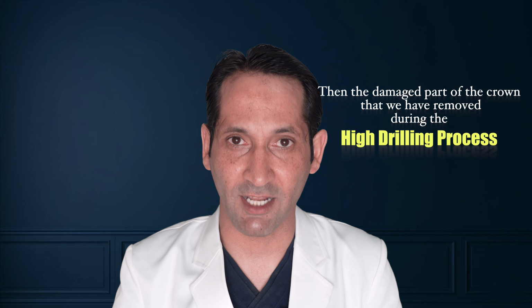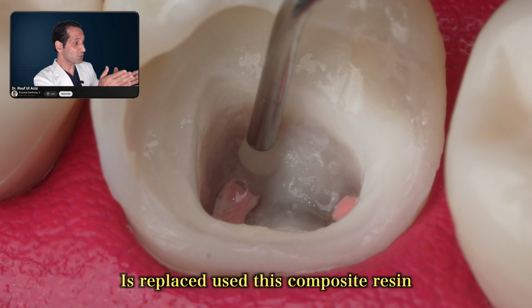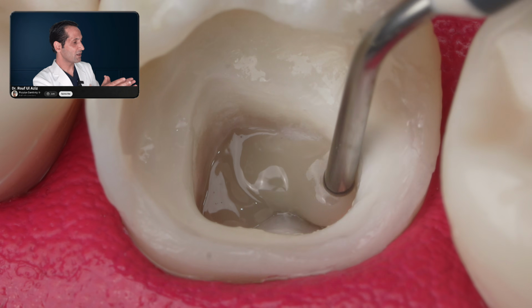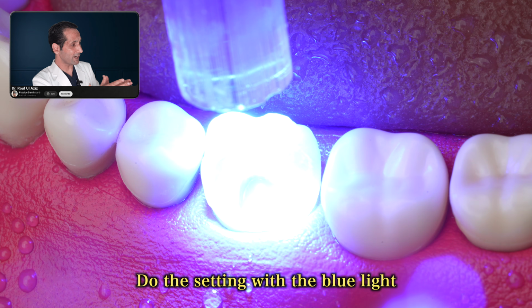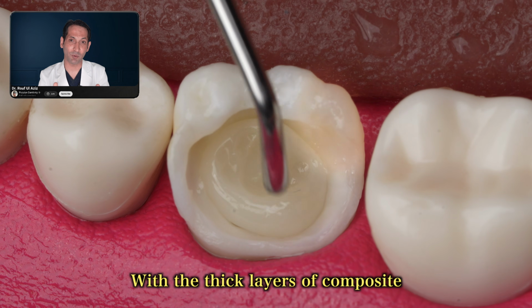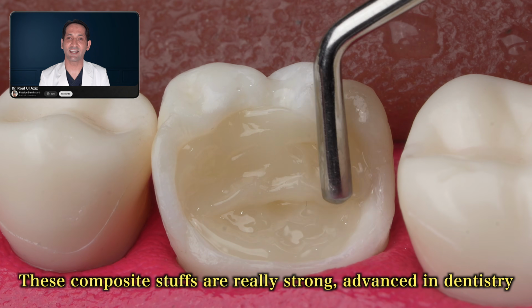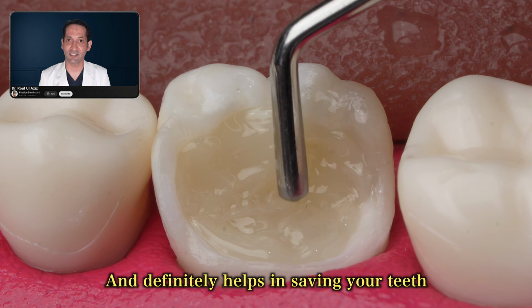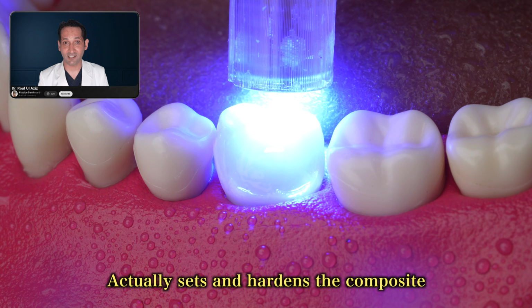Then the damaged part of the crown that we removed during the high-speed drilling process is replaced using this composite resin. First I'm using the thin flowable composite, setting it with the blue light, followed by the incremental build-up with thick layers of composite. These composite materials are really strong, advanced in dentistry, and definitely help in saving your teeth. This blue light, used again and again, sets and hardens the composite.